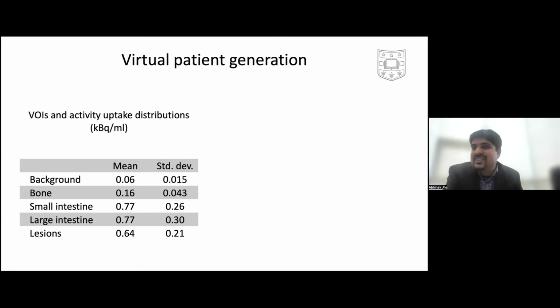Yeah. In the sense that you haven't paralyzed yourself by saying, oh, I don't know this, I don't know that, therefore I'm not going to do it. You make your assumptions, you make a conscious decision and you move forward. Because in some sense, it's an early stage evaluation study, and you get the data and then that data supports the actual clinical trial. Now, when the clinical trial happens, then you get all the data that you can get with that sample size that you have. But if you have to wait for the actual clinical trial, that's too long and too expensive.